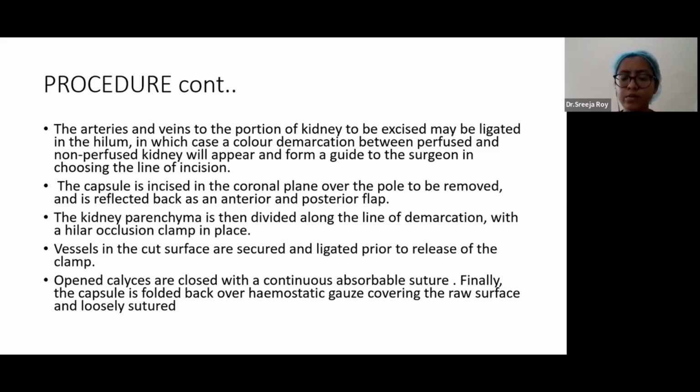To check, we can also push methylene blue through the urinary catheter and see if all the calyceal systems are closed or not. For that, we need to place a urinary catheter beforehand.